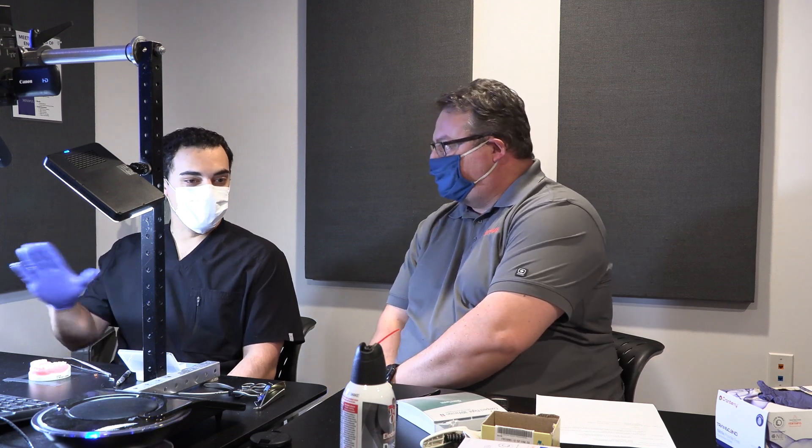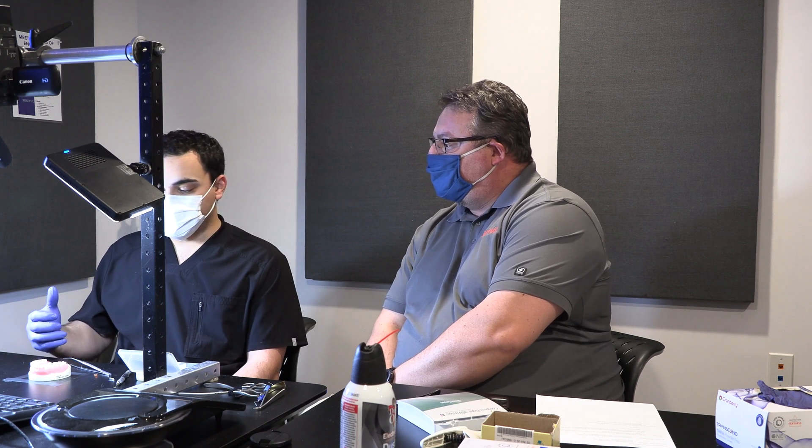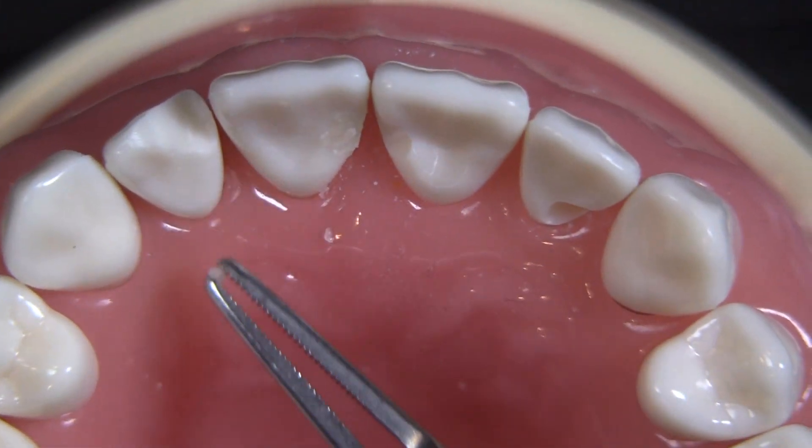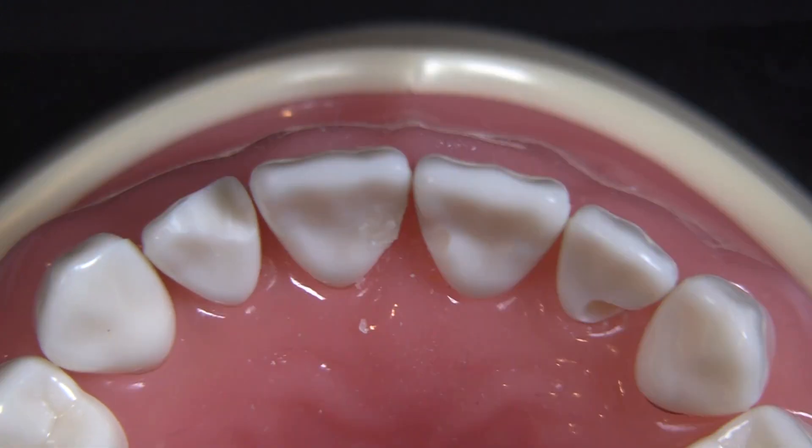For me, I'm a huge believer in large bevel. I like to bevel these preps quite a bit, not only because I get better retention of the composite, but they also blend into the tooth a lot better. So I'm a big believer in doing that — it's kind of built into most of my preps, these larger bevels. That was an important thing too.